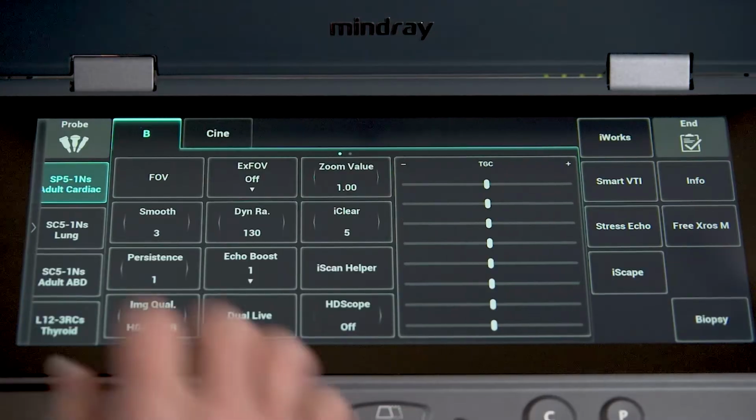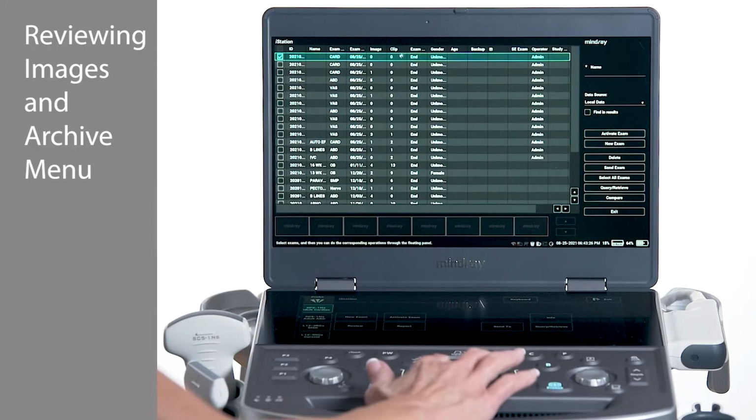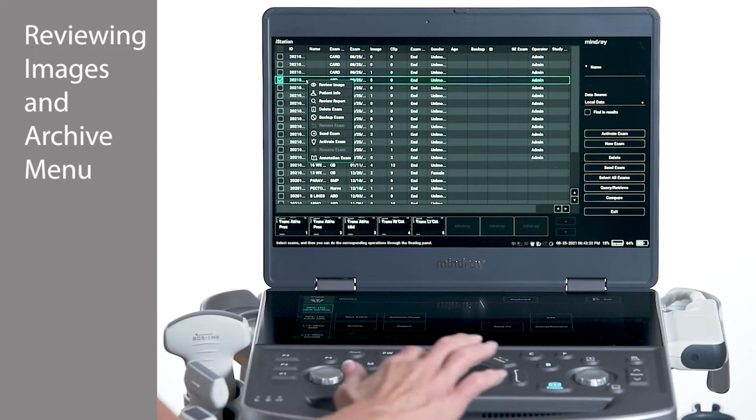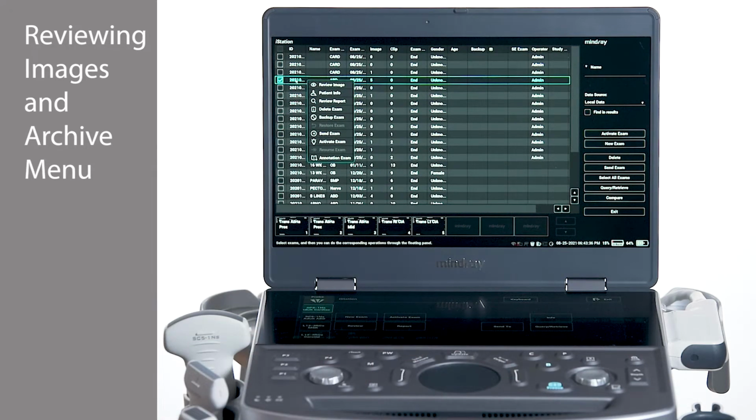Select iStation from the menu screen to access a list with all prior exams. Review, delete, or send past exams from this page. The ME8 has the ability to reactivate an ended exam, add images, or update patient demographics.